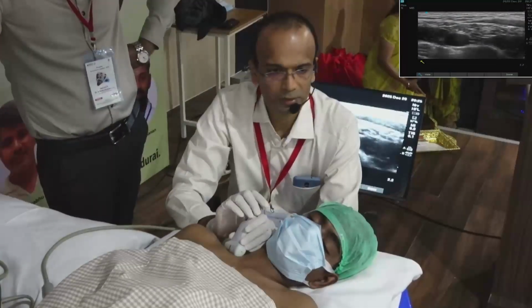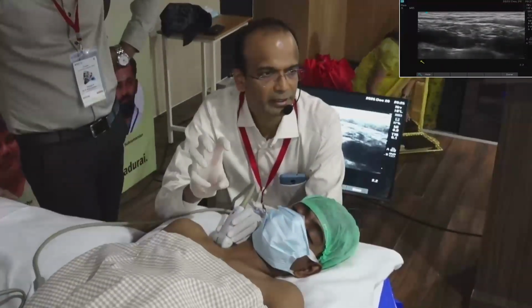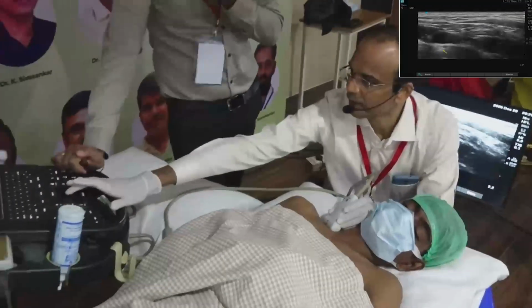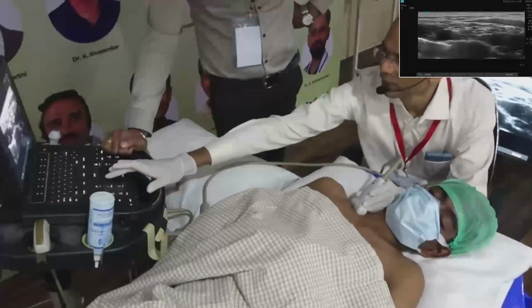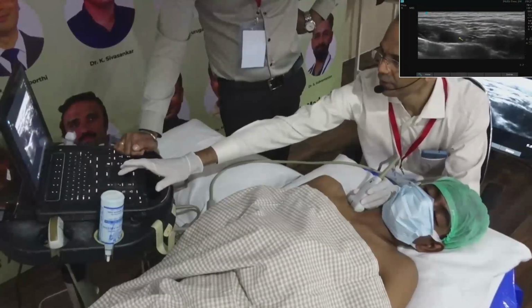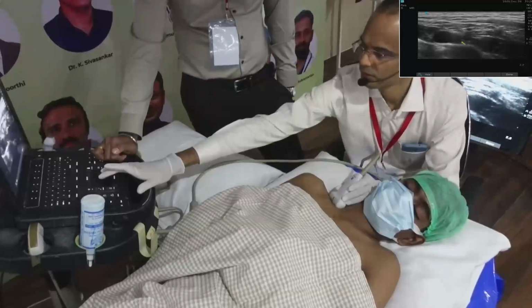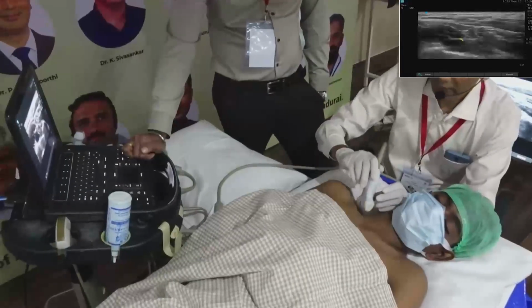Now, after refinement of ultrasound scanning, people are concentrating only on the supraclavicular block, because if you miss this corner pocket, where the lower divisions or lower trunk are, and if you don't identify T1, which may not be seen in all patients, the lower division or lower trunk component can be easily missed in the supraclavicular block. So how we keep the probe is very important.